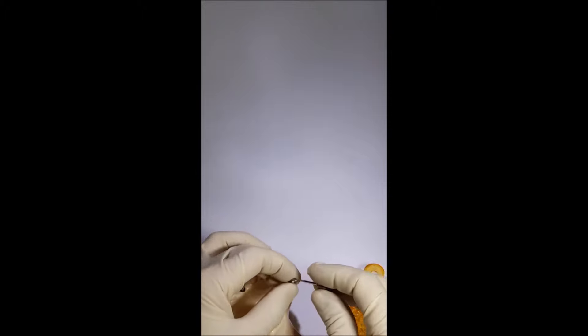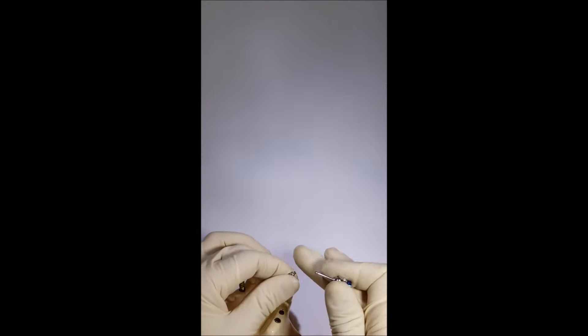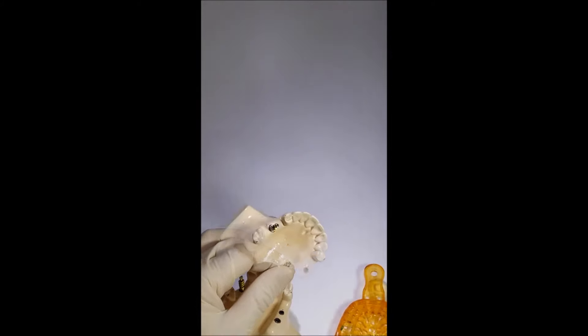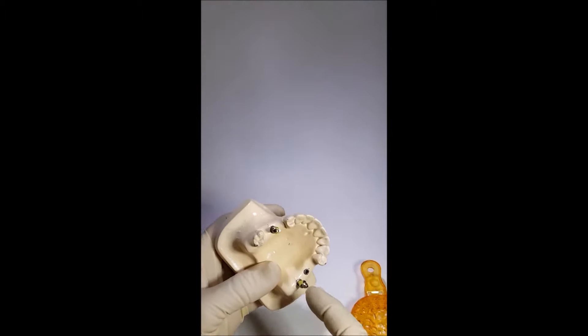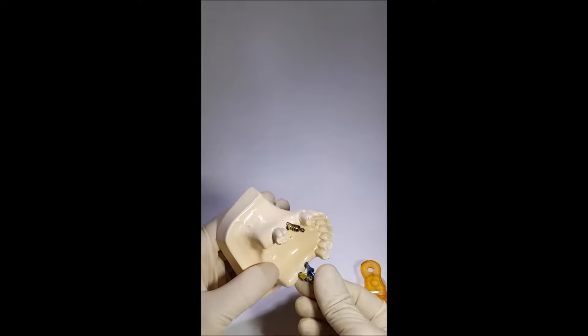There is also a method using a closed tray impression technique with a transfer with clips. This transfer consists of a body with retentional ribs and a clip instead of a screw on the end. This clip may be opened or closed, which provides denser or more stable fixation in the implant.